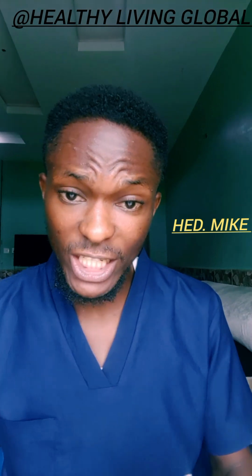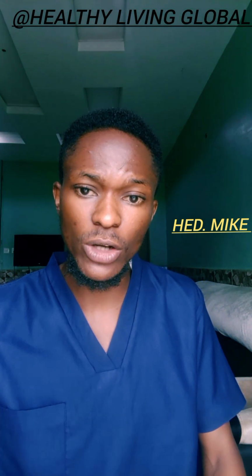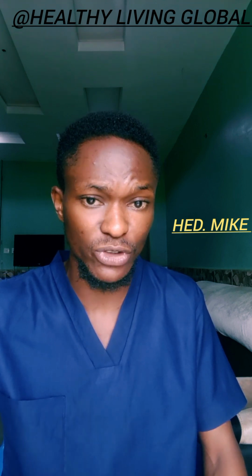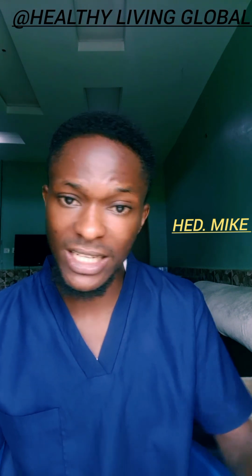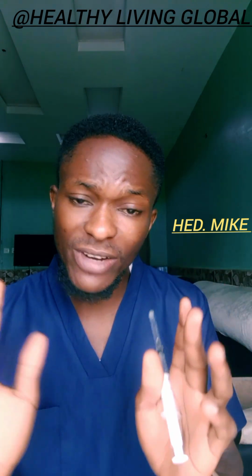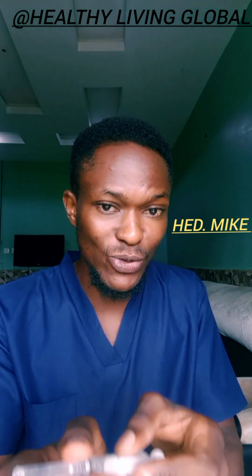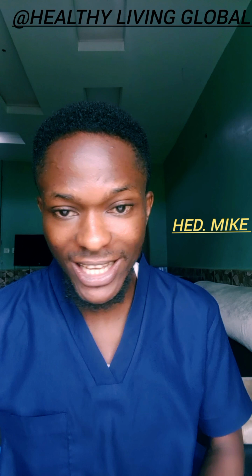So after giving the injection as recommended, gradually withdraw it and apply cotton wool. Just a little pressure of cotton wool on it, to hold it for some time. Then you discard your syringe and needle in a disposable container. Please be very careful, because at that point when you are withdrawing the needle and syringe, if it injures you, sorry for you as a health worker.